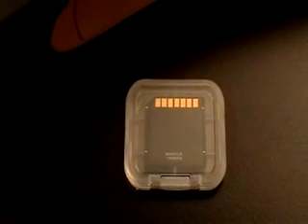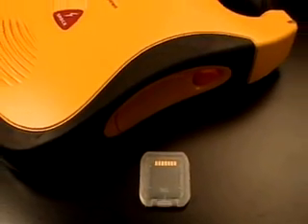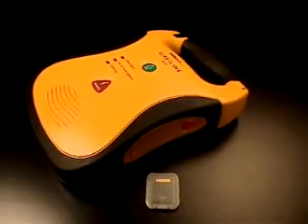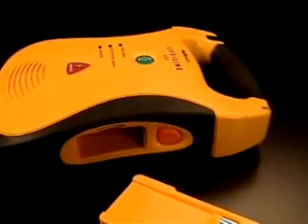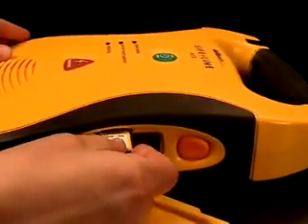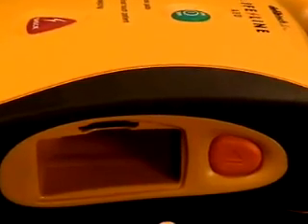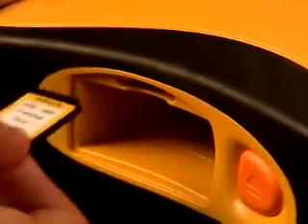The optional data card is used to store extended amounts of ECG data and, optionally, audio data for later review. Note that the Lifeline will store critical ECG data internally even if no data card is installed. To install the data card, first remove the battery pack, then install the data card in the slot located within the battery compartment — insert the card label side up, angled corner end first, and push it in until it clicks into place. When properly inserted, the data card will be flush with the end of the slot. To remove the data card, push the card in until you feel it click; it will be partially ejected and may then be removed.